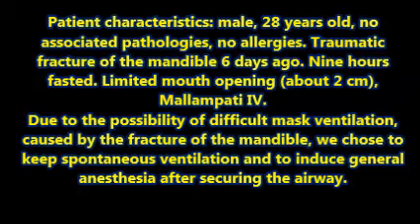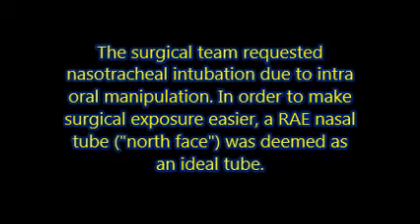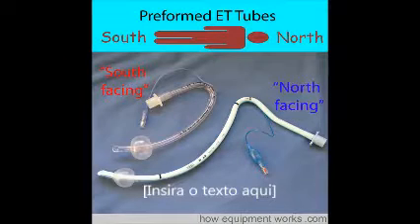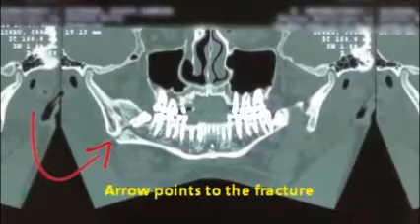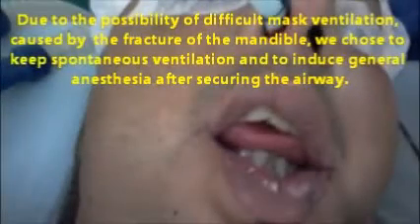The surgical team requested nasotracheal intubation due to intraoral manipulation. They prefer the north face, right angle endotracheal tube. Fiberoptic intubation with this kind of convoluted north face tube is much trickier than with ordinary tubes.